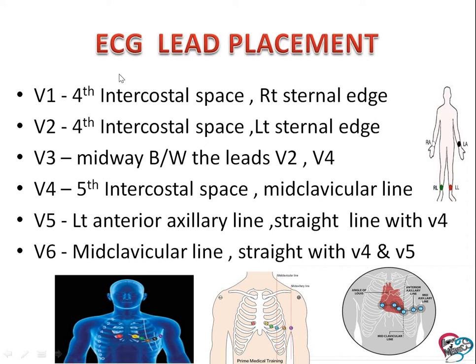in a particular region. First, V1. We place the V1 in the fourth intercostal space. This is the intercostal space and the right sternal edge. Fourth intercostal space, right sternal edge. V2. We should place the V2 lead in the fourth intercostal space, left sternal edge.